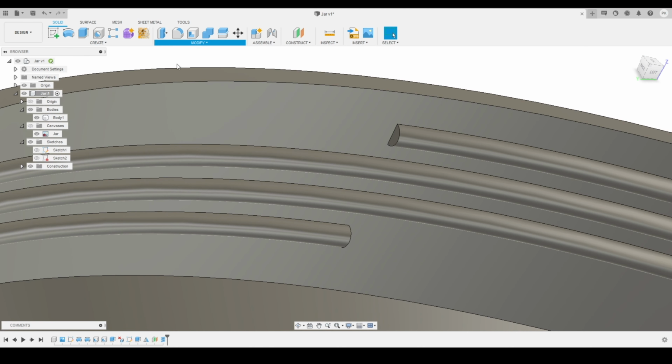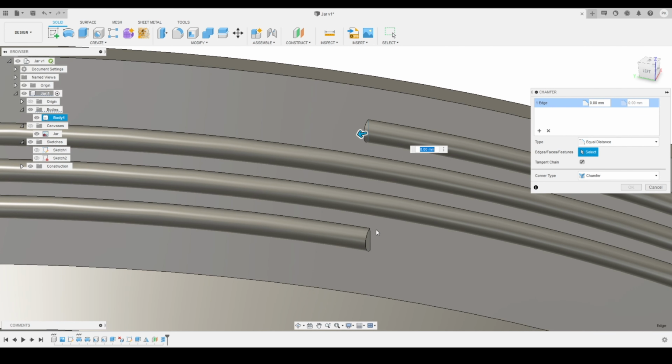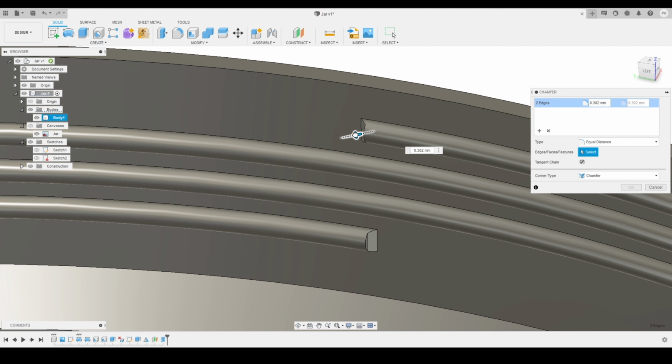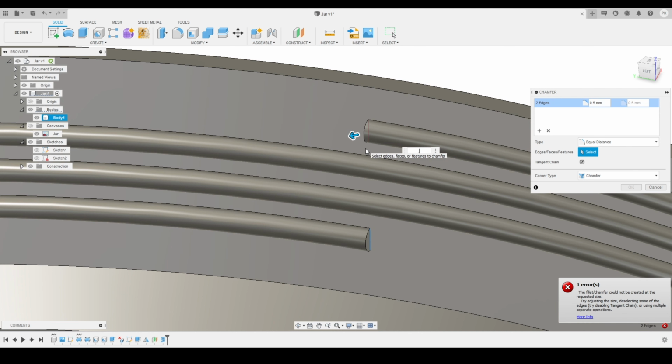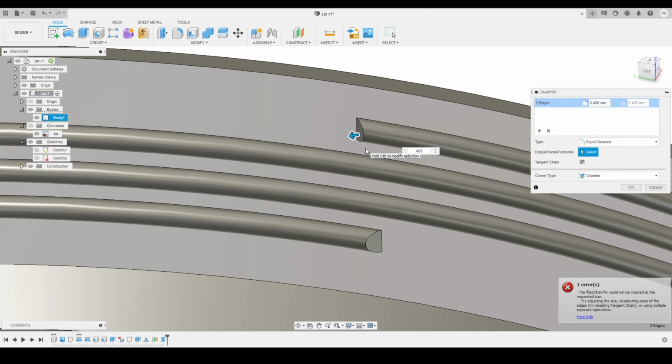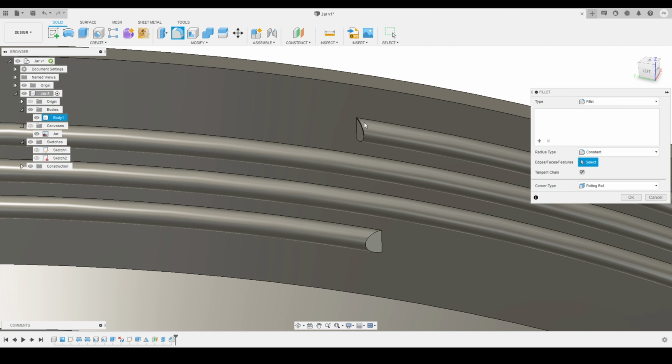Now we'll go on to the modify panel. We'll activate the chamfer tool and we'll select these two corners to chamfer. So these are the corners that I want to chamfer, and we'll apply a chamfer distance. So this one I will just specify the chamfer distance, maybe near to about 0.5 millimeter, or maybe a little bit lesser, maybe 0.48 or 0.49 will work, and we'll press OK. Here you can see this is the result we got.